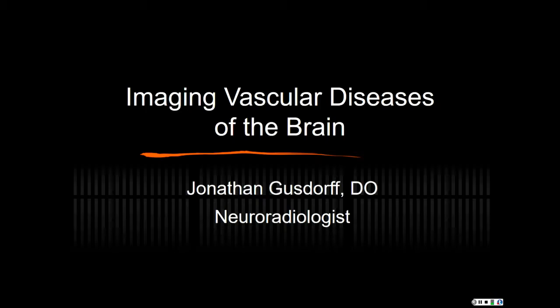Before we get started on the third and final lecture of the morning, I just want to hit a couple of points that I may not have been clear enough on. When you order an MRI of the brain, all of these sequences are obtained during that scan. So if a patient is in the scanner for half an hour, within that half an hour, they're getting that T1, T2, gradient echo, flare, DWI, ADC maps. That's all being done at the same time. You don't even have to order get T1, get a T2, and add an ADC map. It's all done at the same time, or during one setting.